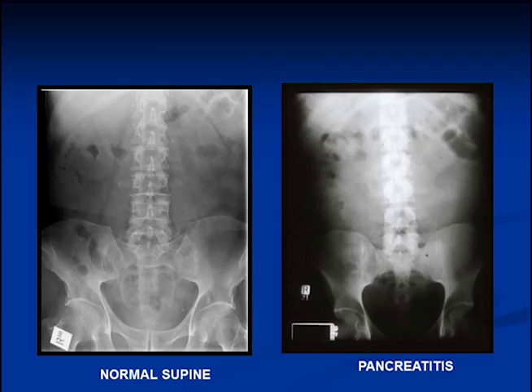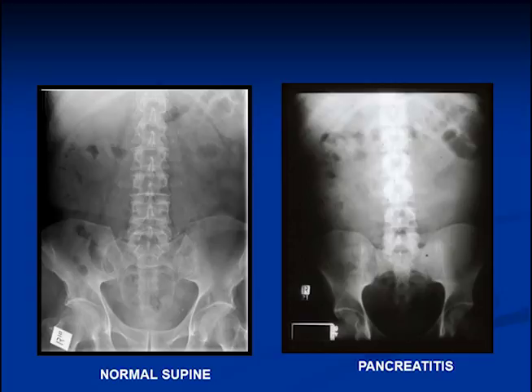Now we'll look at the retroperitoneal structures. The kidneys and both psoas margins are retroperitoneal. What happens when we develop pancreatitis? Pancreatitis is caused by inflammation of the retroperitoneal pancreas, and it causes an outpouring of fluid into the retroperitoneal tissues. This will obliterate all the fatty margins, so when a patient has pancreatitis, we lose the psoas margin and we lose the outline of both kidneys, and you can see that quite clearly on this second view.